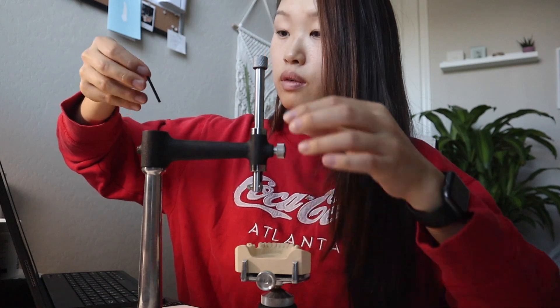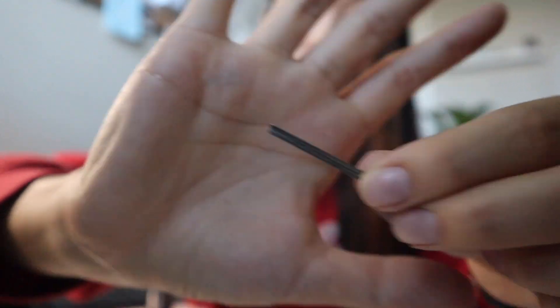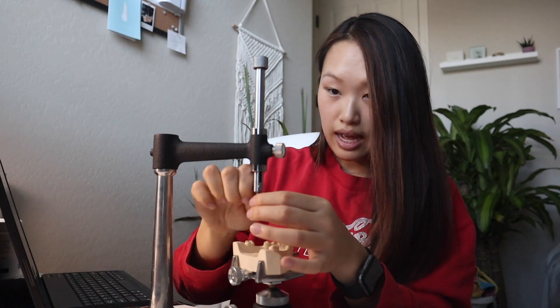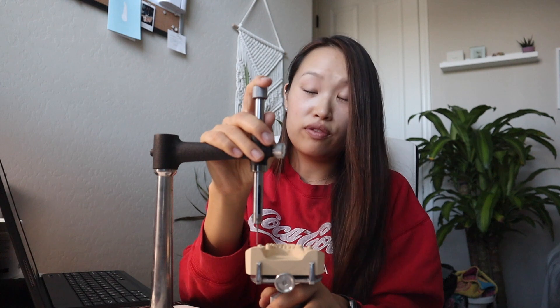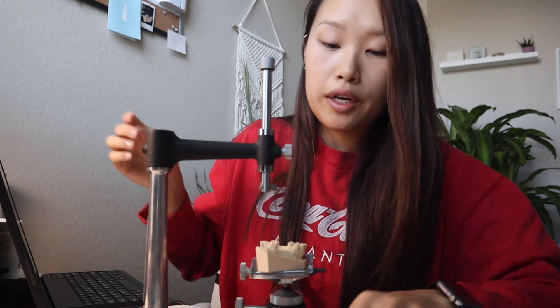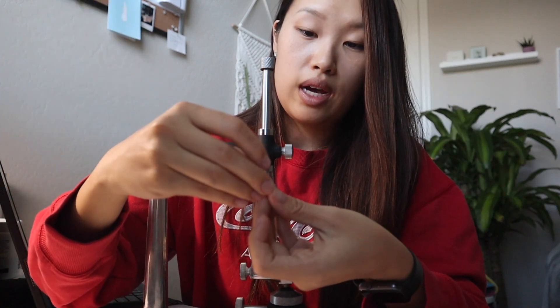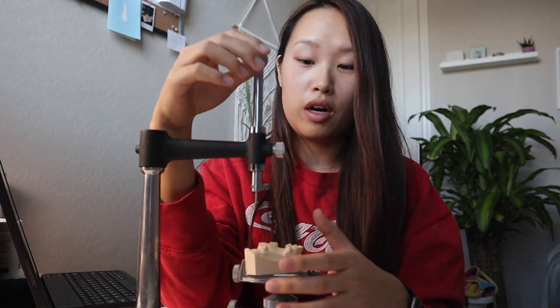So I'm actually going to change it right now. This is a carbon marker and we use it with a metal sheath, which will help us draw our survey lines later. After I've checked that everything is parallel I'm going to go in and look at the undercuts. I basically just want to look for a little triangle once the rod is placed up against the side of the tooth. Now the next step is to replace this with the carbon marker and I'm going to make sure I insert it into the metal sheath so that it doesn't break. Using the side of this carbon marker I'm basically just going to go around the tooth and mark the height of contour.